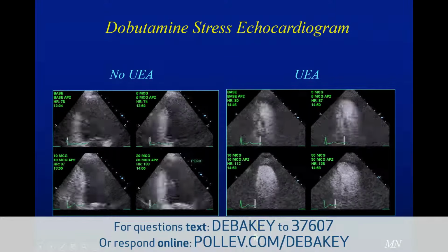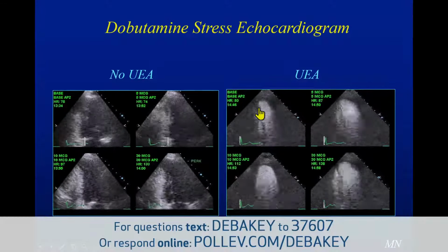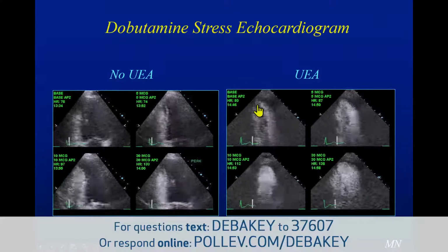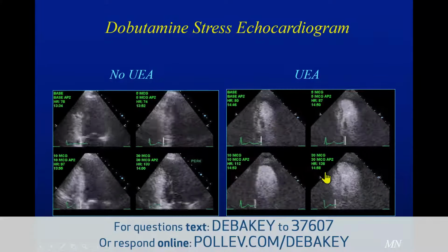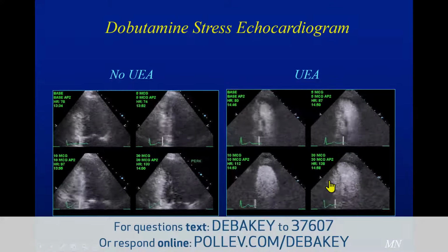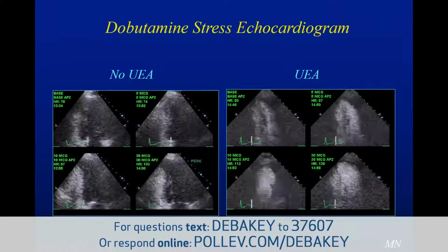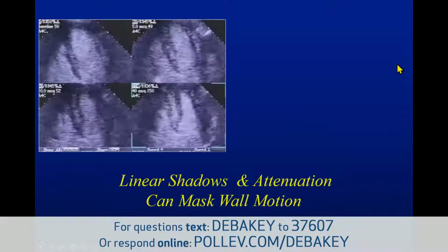Let's see what you see here. Well, interestingly enough, number 1 is that this individual had a previous infarction. So at baseline, this wall motion abnormality that we suspected was mostly during stress is actually present at baseline. And notice what happens during stress. There is a larger ischemic area. This is at maximal stress, and you could see that progressing gradually from 5, 10, all the way to 30 mics in this individual. So the interpretation is very different. The extent of ischemia is different. And this individual had a baseline abnormality even to start with before the stress.